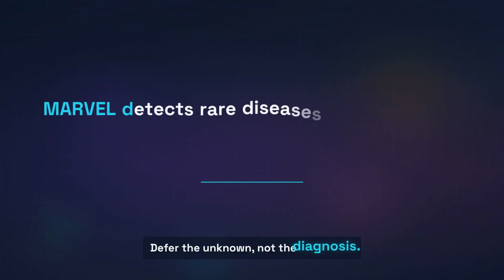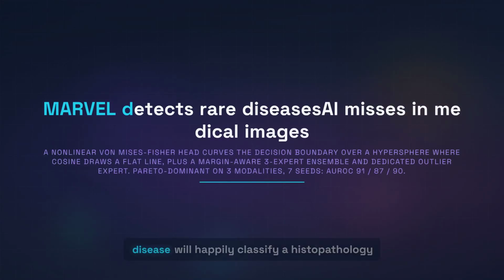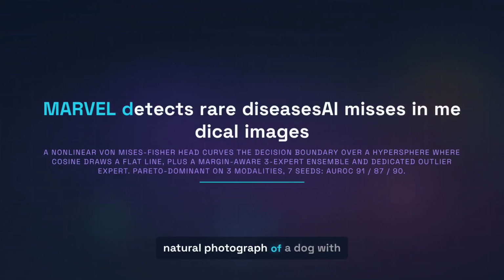Defer the unknown, not the diagnosis. A retinal model trained to flag disease will happily classify a histopathology slide, a corrupted scan, or a natural photograph of a dog with high confidence. In a clinic that is dangerous, an out-of-distribution input must be caught and sent to a human.